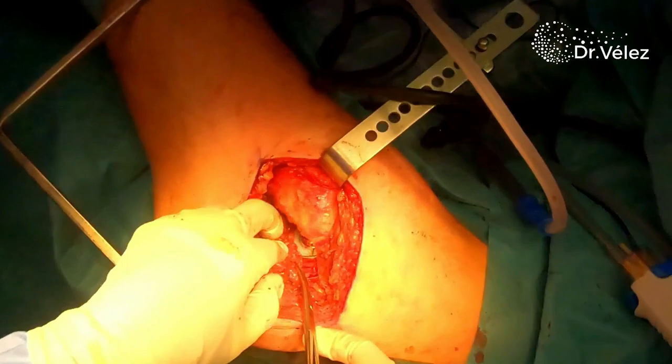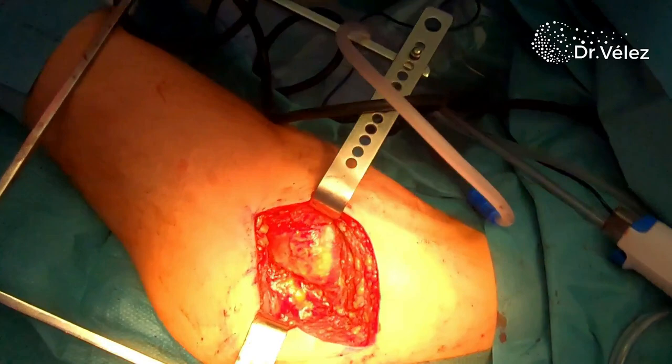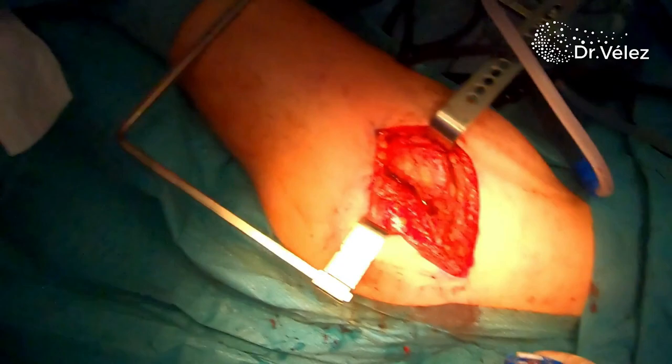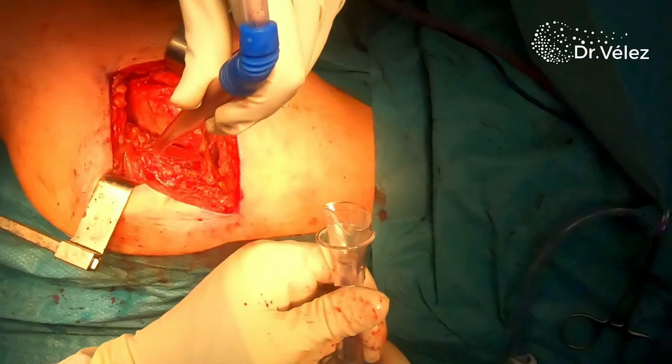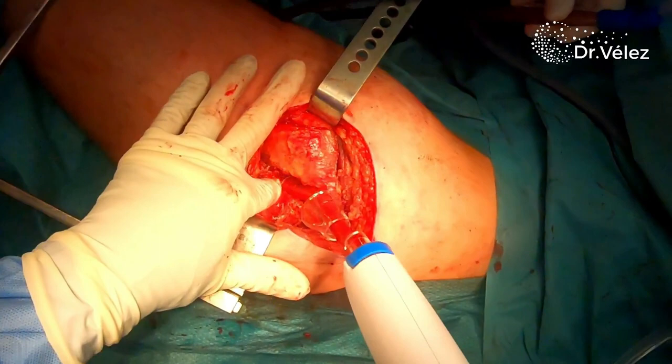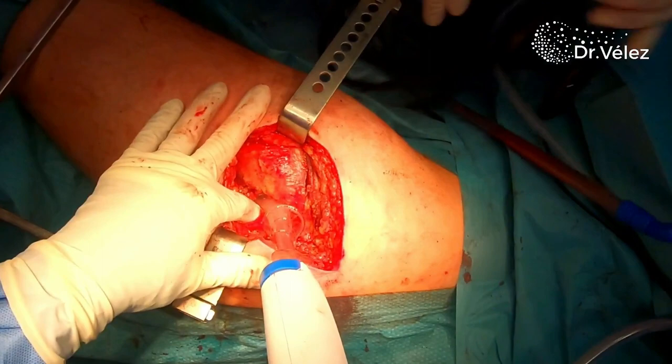After implanting the definitive bipolar head, we reduce the hip correctly and we check again for stability in internal rotation and flexion, and also for tension in extension. We also repeat a clean out, wash out of the soft tissues before closure, and check again for any bleeders that would need to coagulate.